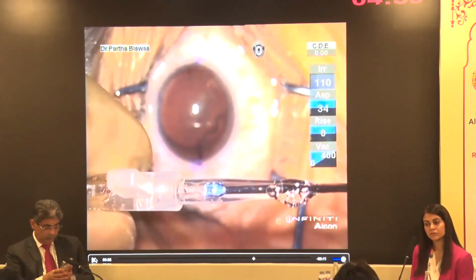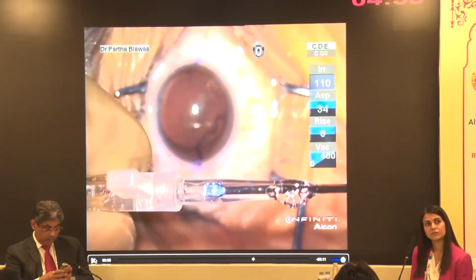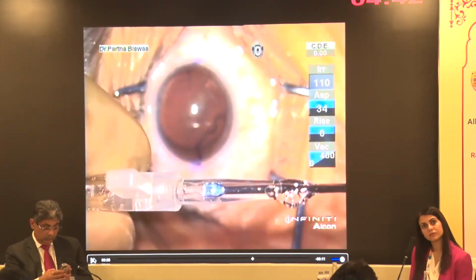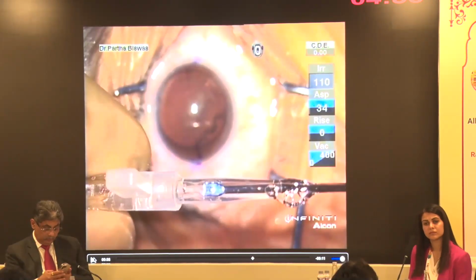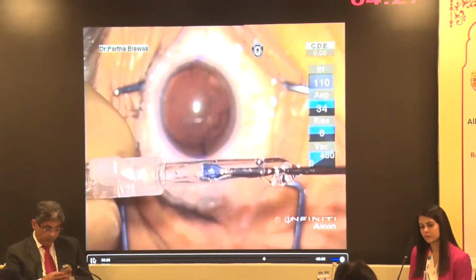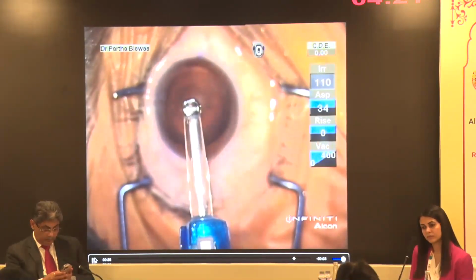They have to coincide and then start pulling. If you feel that it has not coincided and you're actually gripping only a small part, please re-grip so that there's a good pull. Now, with the pull inside, there also should be a slight movement outside. So the hub going outside, the pull going across, thereby a very smooth glide of the rotation of the ICL that is going in round, and it comes to the tip. If you lose grip and it is only halfway, you can really push it back again, nicely re-grip and take it up.